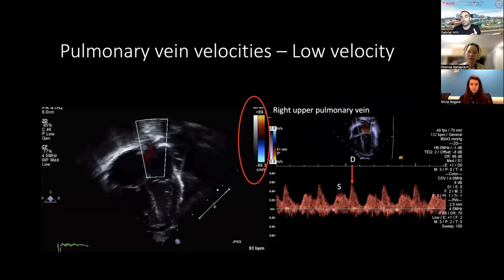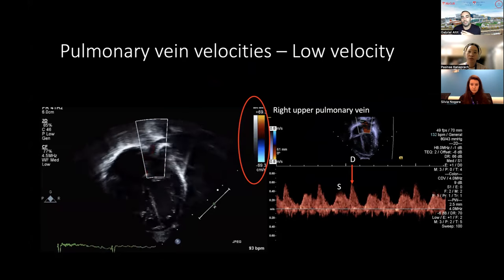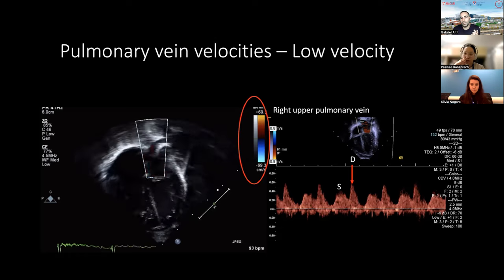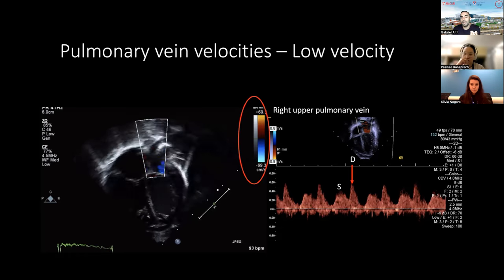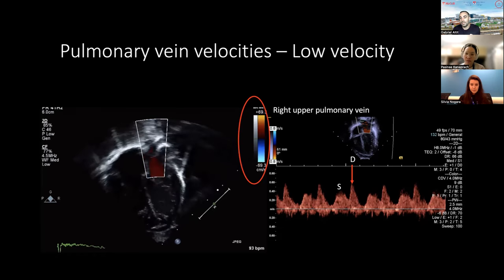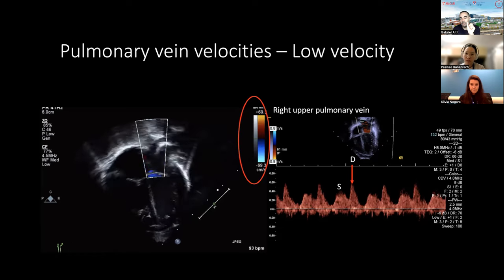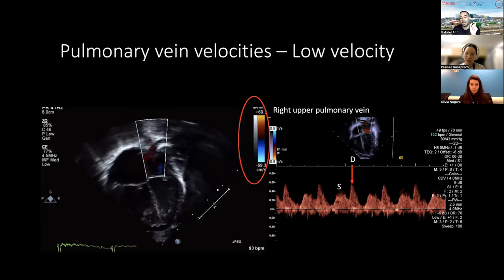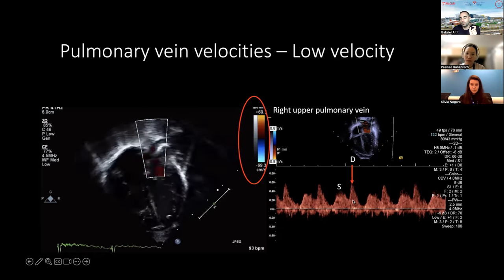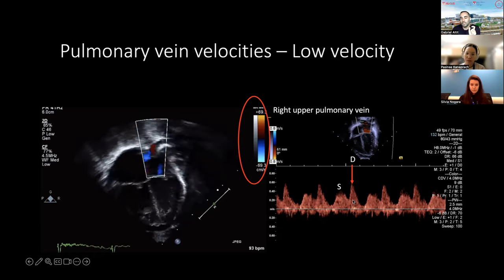So we don't know if this marker is still reliable for estimation of the left to right shunt via PDA at older stages, like for example, when the kid is now 7 or 8 weeks of life, because maybe the vein is not as narrow anymore and your D velocity will start going down. Does that make sense what I just said?